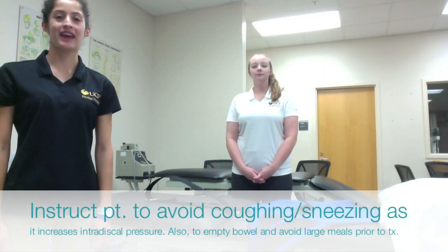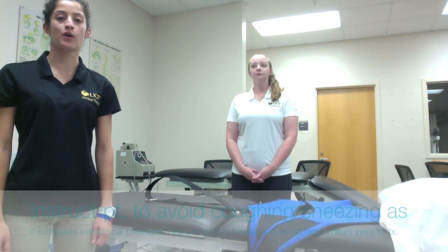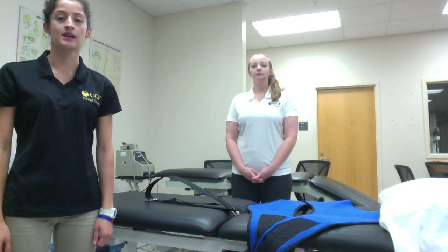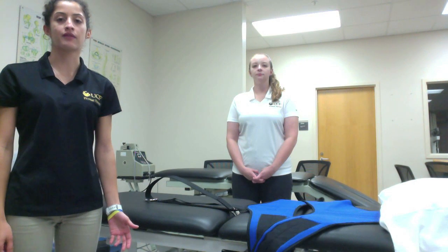Today I'll be performing mechanical traction on a patient with osteoarthritis at the facet joints localized in the L4-L5 area. For this reason, I will have the patient supine with the hips flexed, and we will get this by placing a stool at the knees, which will also create a lumbar flexion.